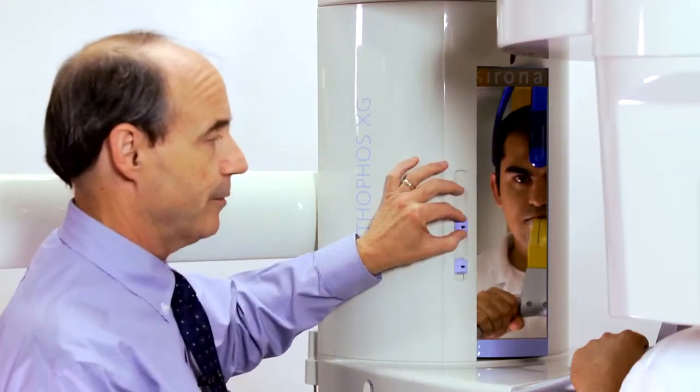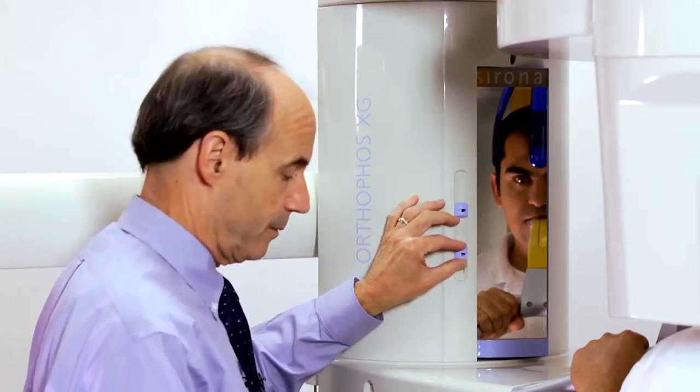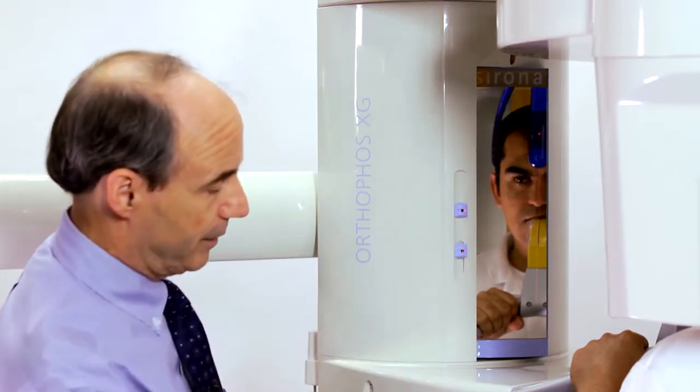Alternatively, you can raise this laser and raise the lower one, and then collimate just the maxillary anatomy. In this way, you can reduce radiation exposure to the patient and still receive a high quality volume.